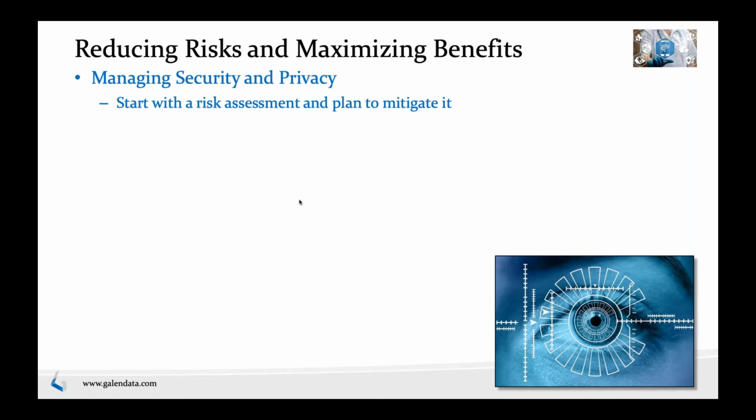There are different ways of doing that. There is a framework available from the National Institute of Standards and Technology, called the Cybersecurity Framework. That framework has some ways to do threat modeling. So that's what you start with, threat modeling.